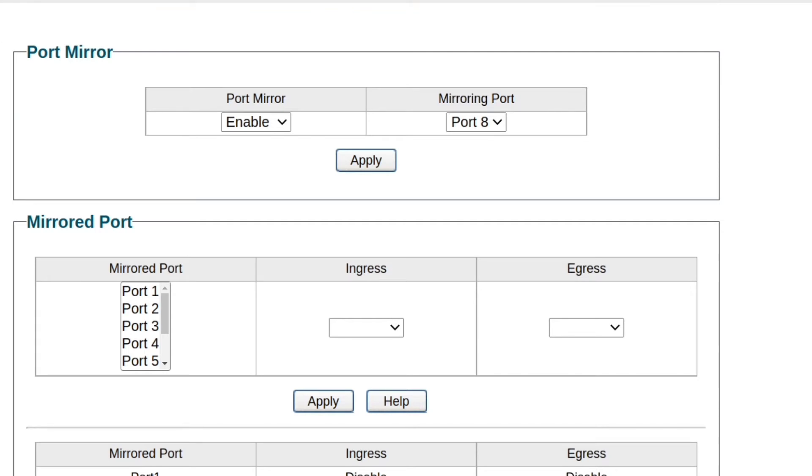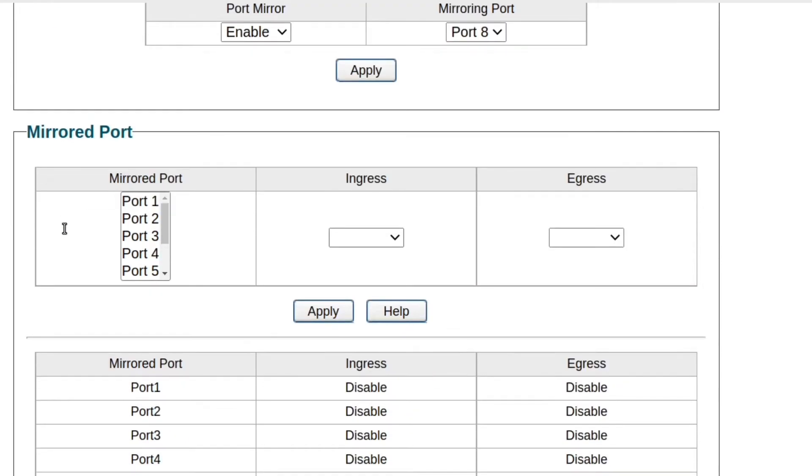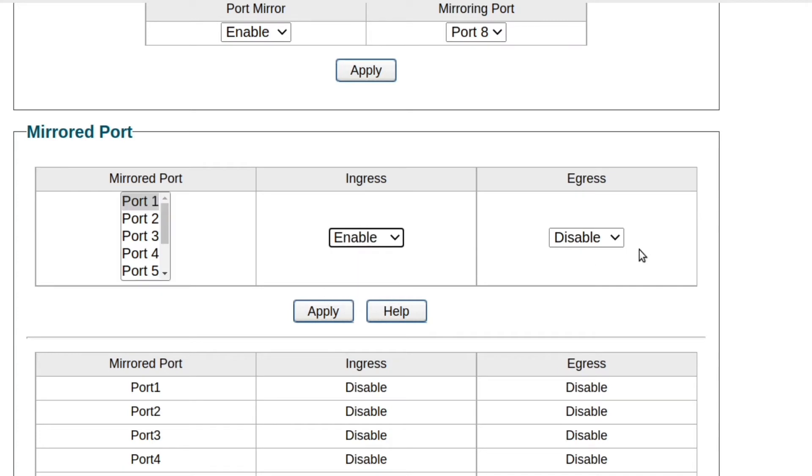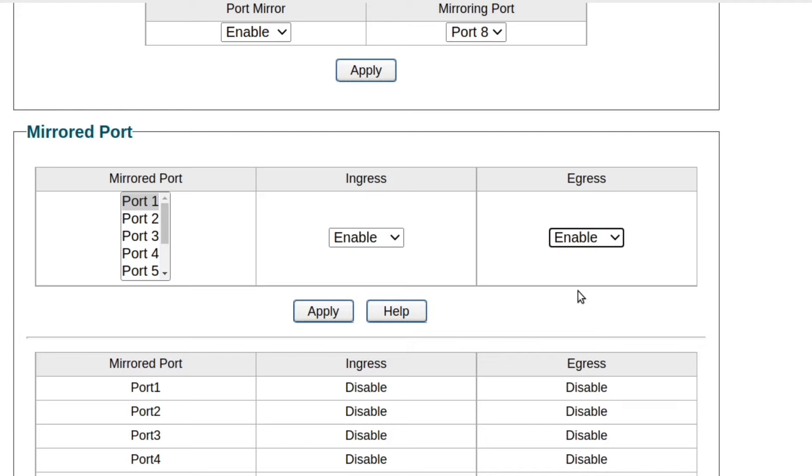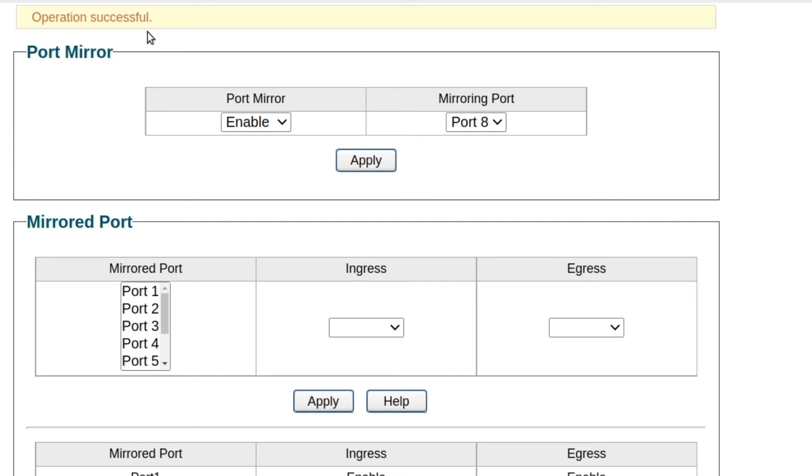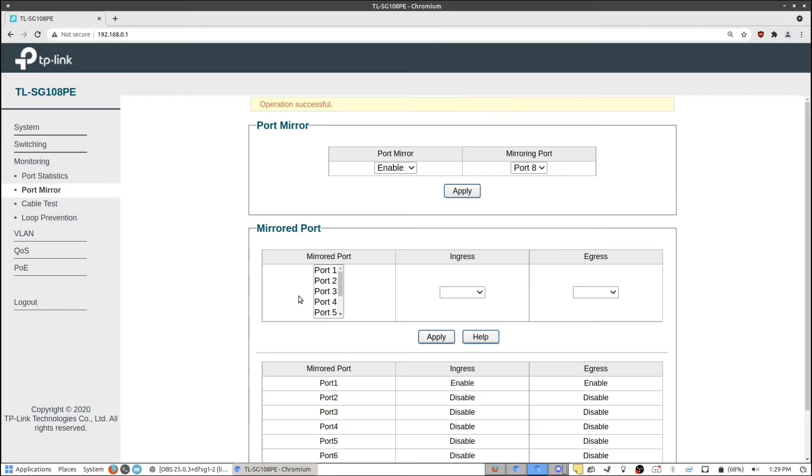So what we're going to do is choose what ports we want to be mirrored. In this case, I want to have port 1 be mirrored. So I'm going to select port 1. You can see over here, we have ingress and egress. We want both to be enabled. So any information going in or out of that port is going to be copied. And click apply. And you'll see here, operation successful.